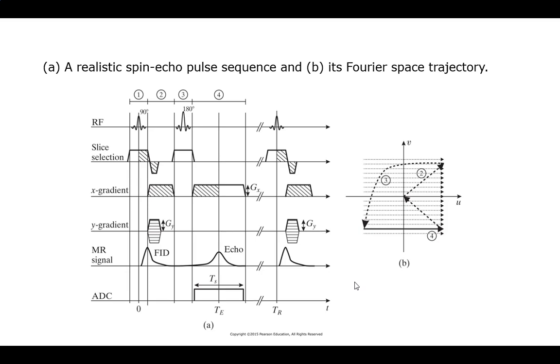Yes. Plus, I've got both sides affecting. Right, so this may seem weird, but if I did it on this side, I'd have to do it on that side. Oh, I see. So it's kind of like it's upside down, because you are literally flipping it. And so there is a little bit of automatic cancel out happening between the 2 sides.